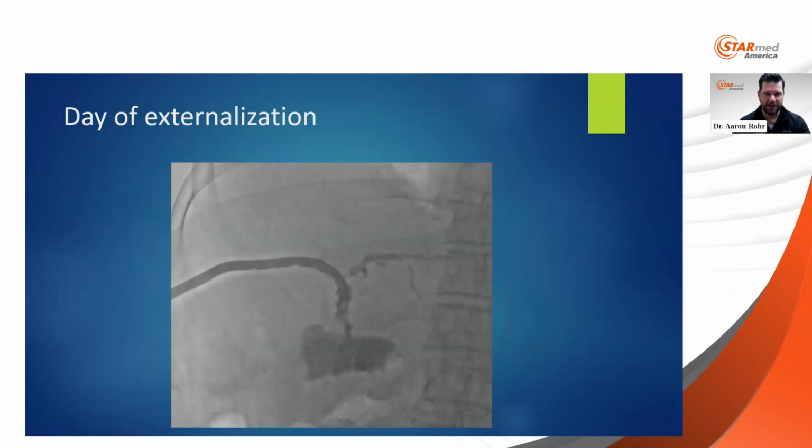So here it is again. This is with the drain in it, proximal to the anastomosis, terminating around here. So we want to make sure that everything's draining, even with this just access drain capped. And we can still see after contrast injection, things are transiting quite well.